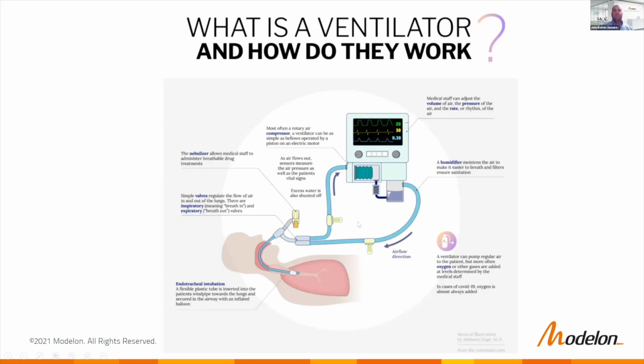So what is a ventilator? I'm sure everyone knows. It's a device that hooks to the patient who can perhaps not breathe at all or only partially breathe. The device basically puts air into the patient and also can help with the exhale process by removing air from the patient. There are valves that control the airflow. It's computer controlled to set different amounts of breathing assist and different rates based on what the doctors prescribe. So that's a ventilator. I'm sure many people have seen them, and unfortunately, I think a lot more people have seen ventilators now than had ever seen them before.